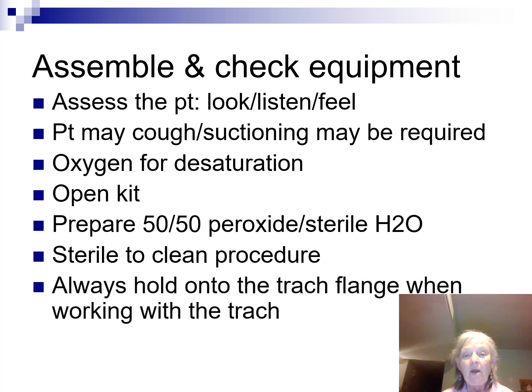And this is really important because people forget to do this. When you're working with this trach, you must always hold on to the flange. And people will go, well, I don't have to, the trach ties are still in place. Okay? If that patient is coughing and he's moving the trach a little bit, he can actually move it out, and now you got a problem because the trach is misplaced. The other part of it is, once you do take those ties off, you need to make sure you hang on to that trach because the patient can cough and cough that trach out. It happens, and people don't believe it until it happens to them.